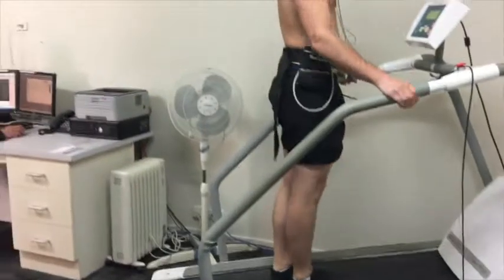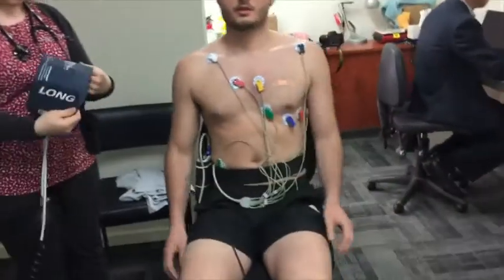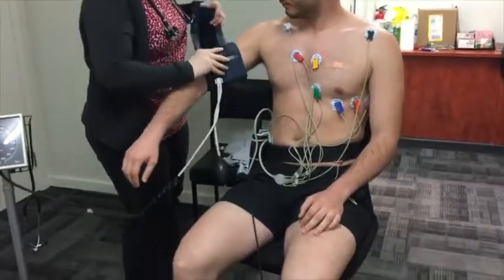The treadmill is stopped when the maximum heart rate is achieved; however, it can be stopped at any time if required. After the treadmill comes to a complete standstill, you will be asked to come off it and sit on a chair while the ECG is still being monitored.